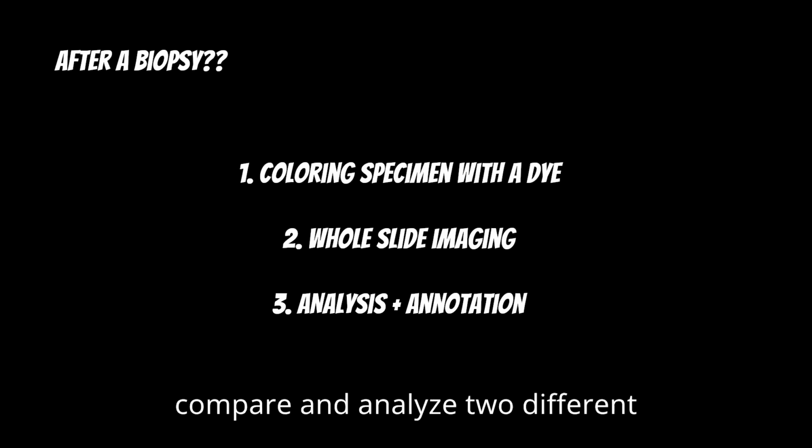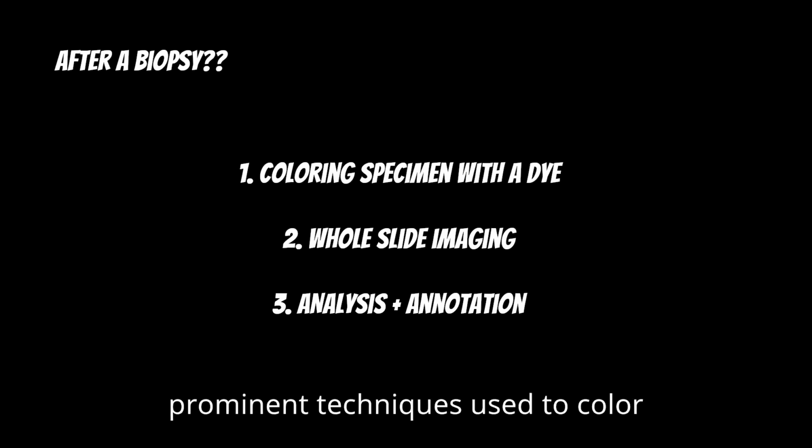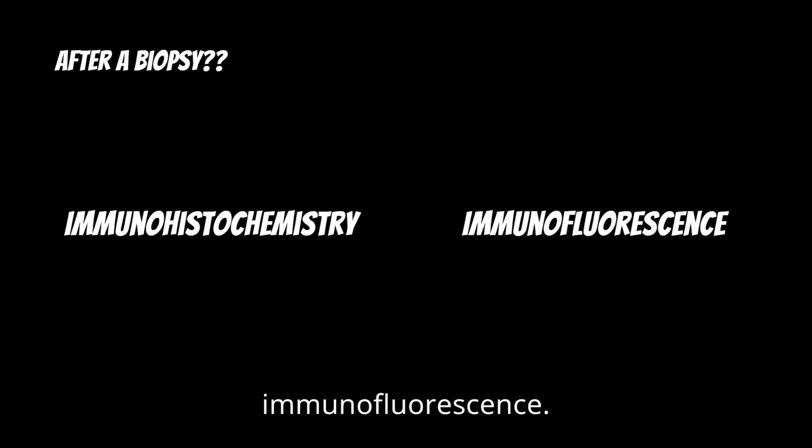In this video, we're going to compare and analyze two different prominent techniques used to color specimens for observation: immunohistochemistry and immunofluorescence.